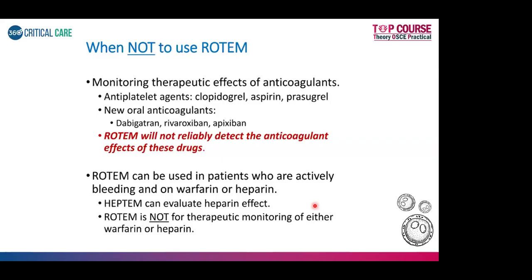Secondly, what other problem is there with ROTEM? Actually, the clotting factors should be there. If the R time starts, only then can it proceed further. If the clotting factors are initially very depleted, then the graph won't even start. That's already the function of TEG. But what does it skip? What is one vital step in the body, in vivo condition, which is skipped here? Temperature. Calcium also it does not measure.